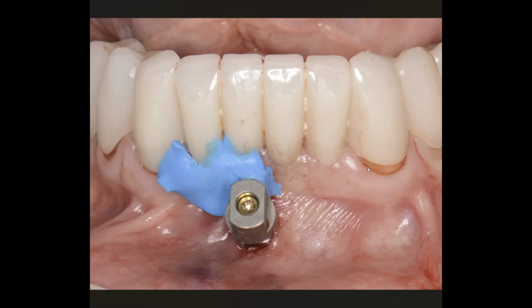And also, the other reason I did it, digital workflow. You can scan from the chin, you can scan back one side, you go back to the chin, scan the other side, and guess what? You've got better alignment because you're not going all the way across the arch and around the curvature. You're going just linearly, midline straight back, midline straight back. And the deviation in the posterior is far less than if you were to start on one side and go all the way around.